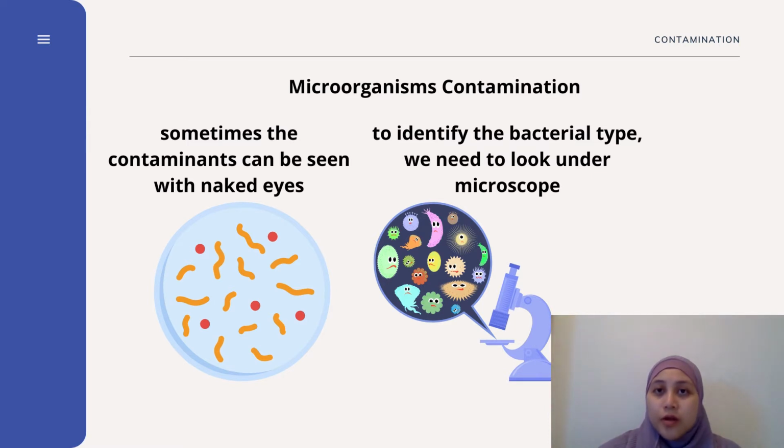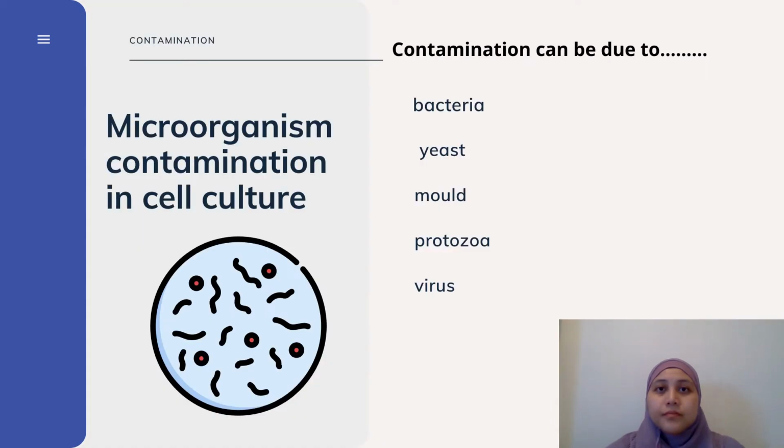How do we identify microorganism contamination? Well, sometimes if they are present in abundance, you can see the contaminants with your own eyes. Example will be fungal contamination. However, to see more clearly and identify the bacterial types, we need to look under microscope under higher magnification. Contamination in cell culture can be from bacteria, yeast, mold, protozoas, and virus.